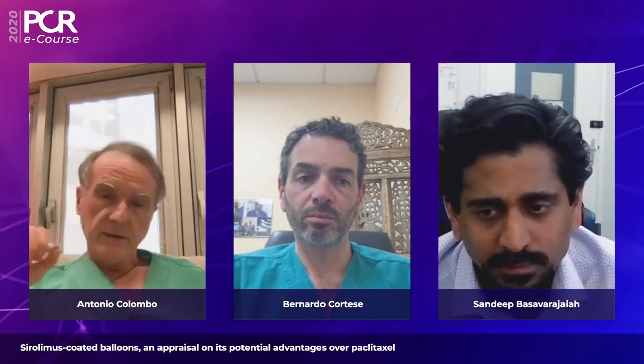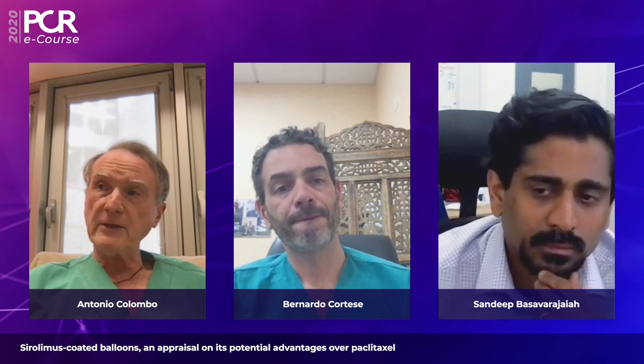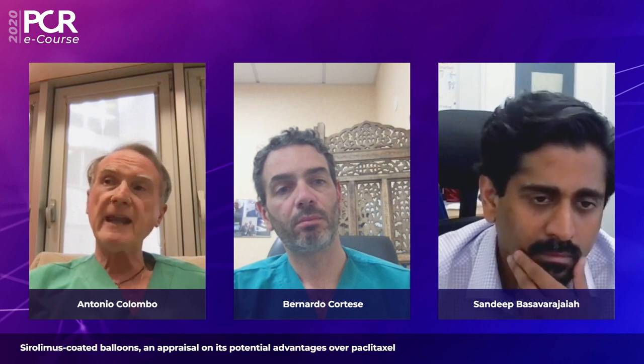No, I think this is something that we have done for years. We published a paper in JACC about focal stenting, spot stenting many years ago. And we also have now long-term follow-up of patients treated with a drug-coated balloon and drug-eluting stent on the same lesion. This has been a lot of trepidation to use two drugs or to use double dose of the same drug, and we have not seen any long-term adverse event or effect. We didn't see any vessel aneurysm or any risk of late thrombosis, and we have now follow-up over 3-4 years.